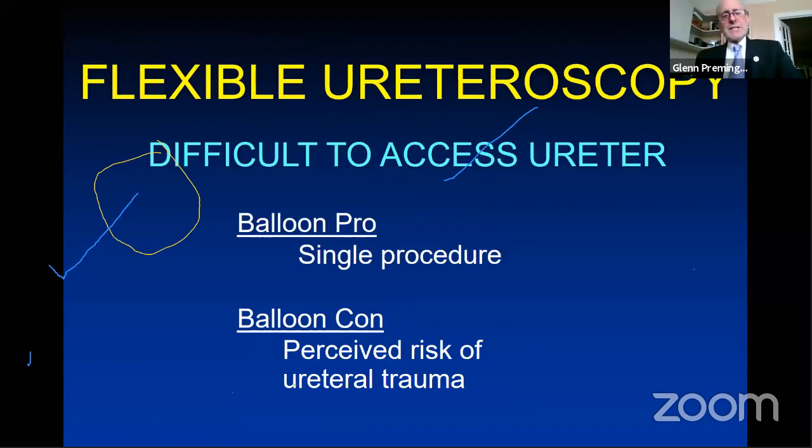Well, what about balloon dilation? If you can dilate the ureter, place your access sheath and complete the procedure, now you only have to do a single procedure, but there's the perceived risk of ureteral trauma for those patients that would need balloon dilation of the ureter.